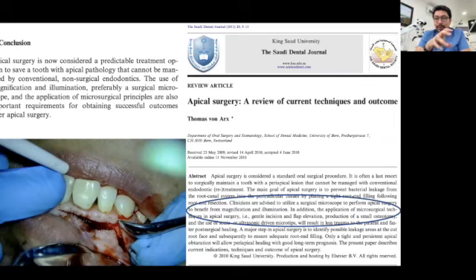But the clinical microscope, the operative microscope in general, is a tool, a device that really helps us to increase the success rate of our treatments, and it is evident when we think about microsurgery. The success rate of periapical microsurgery before the microscope was around 75%, according to some reports. Nowadays, we have a success rate of 95% in periapical surgery, which is the same success rate of a regular root canal treatment. Why? We have more precision, we have better abilities for providing a proper diagnosis, and it was the problem when we look into the past.